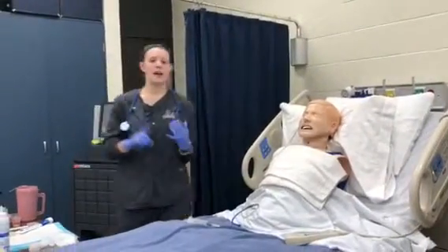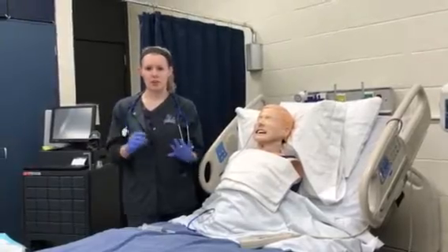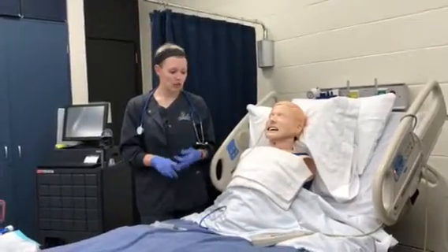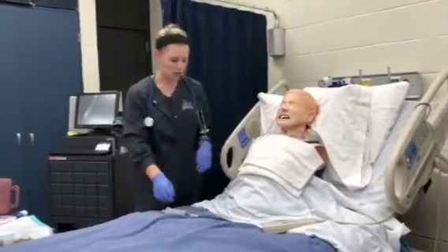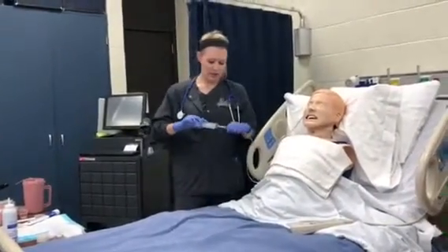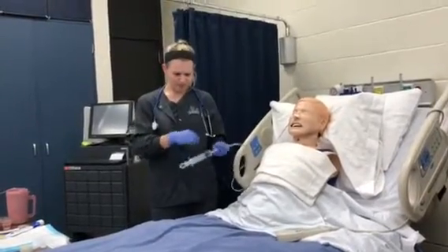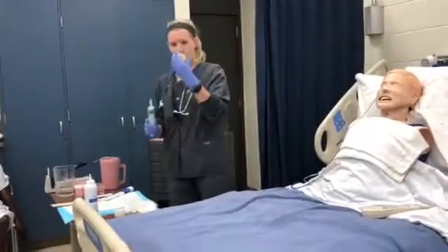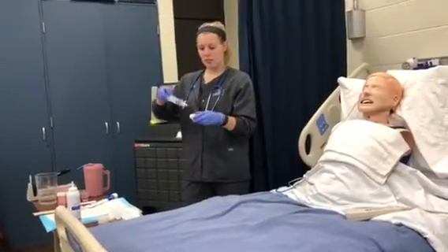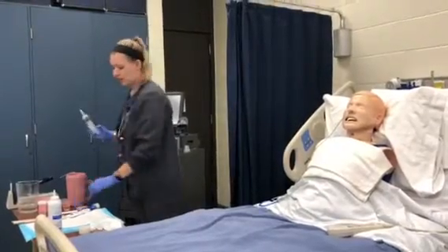Another way to tell is by x-ray, which I can't do, so x-ray would come up and then they would verify that it's in the right placement. And then the last thing that you can do to check placement is a pH residual. So I would just attach my syringe, take back some of the acid in the stomach, get some fancy pH paper, put the stomach contents on the pH paper, and depending on what the pH is, it's going to tell me if I'm in the stomach or not.